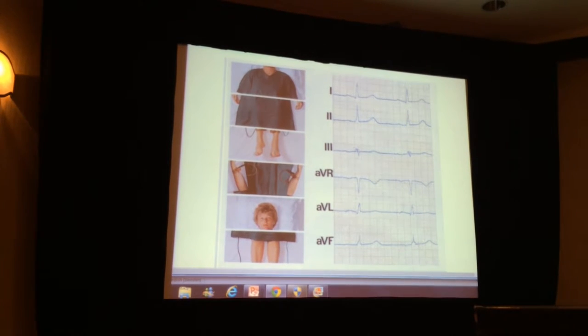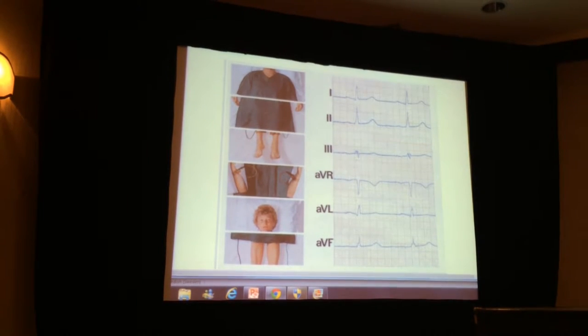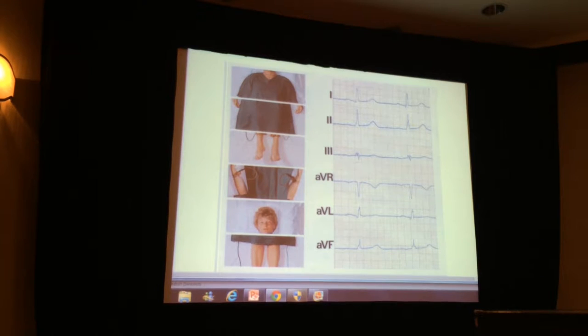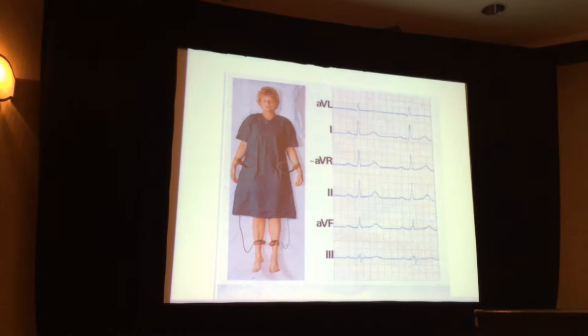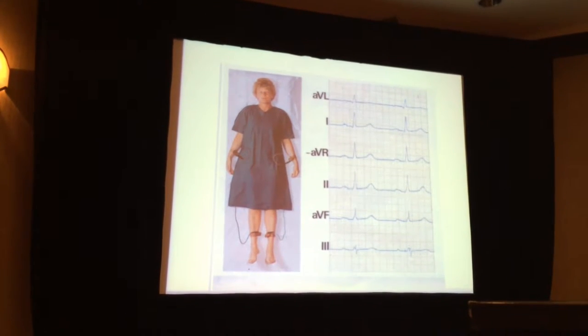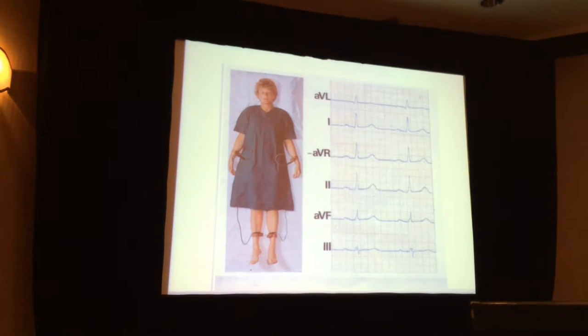Now, one way of emphasizing the difference would be, imagine trying to actually look at an individual in the way we looked at the disorderly sequence and trying to visualize the individual. We would see different views of the individual, but none of which added up to looking at the individual. On the other hand, if we looked at the orderly sequence of leads from, again, aVL around, including minus aVR, we would see what looks like the frontal view of a person. So one can imagine all kinds of ways that there might be some advantage to the orderly sequence, but what are some of those advantages?